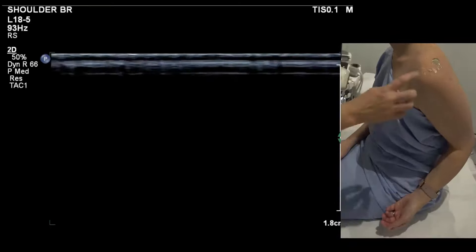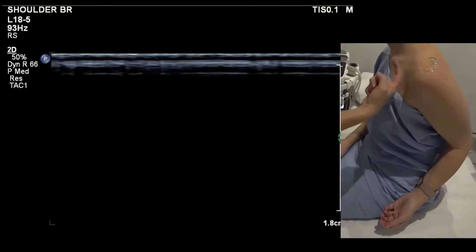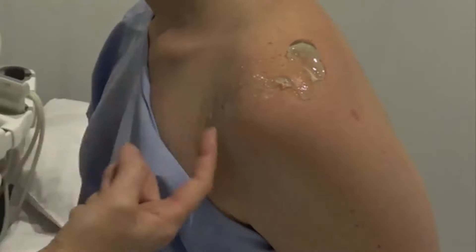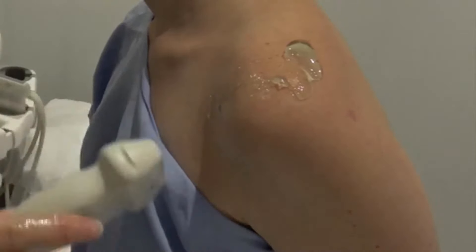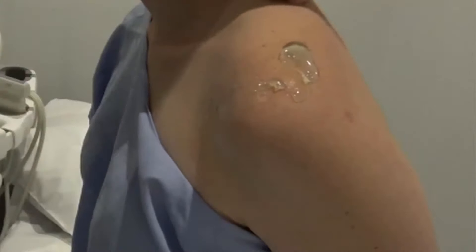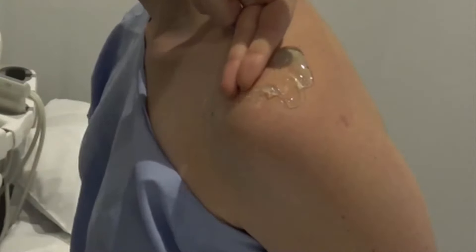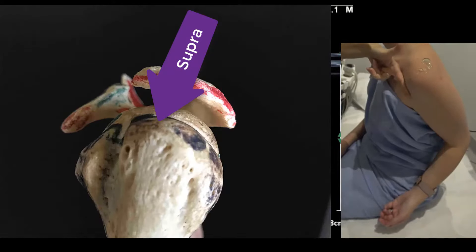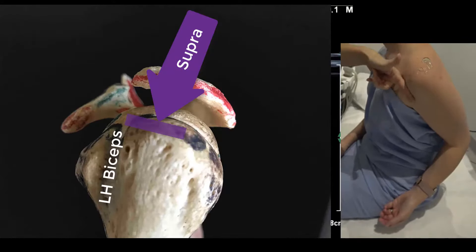Tuck their wing in nice and close, encourage them to draw the scapula in, and aim nice and low — you don't want to pull the tendon too tight. You can see this natural groove on everyone — that's the deltopectoral groove. Supraspinatus wraps from the supraspinous fossa around to the front and sits immediately behind the biceps. So that groove is essentially where our biceps is.